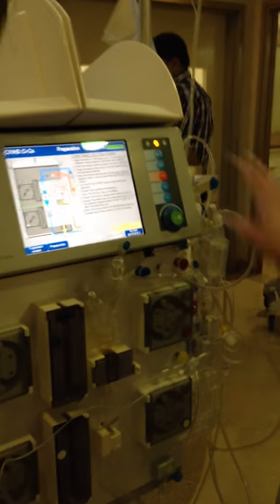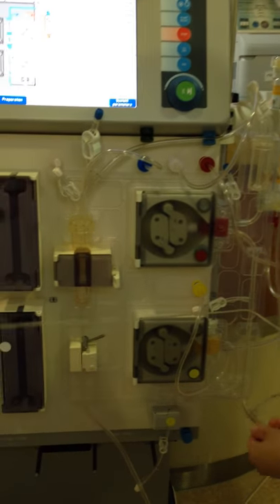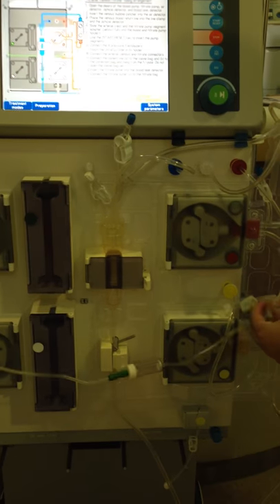Now, I just want you to look. Check your connections. There, it's all the same. Except for this one. Only for this one. And then this one, no? This one and this one. That's the one. The difference. Yes. The ordinary. Okay. Do not pull. Okay, go on, that will get damaged.